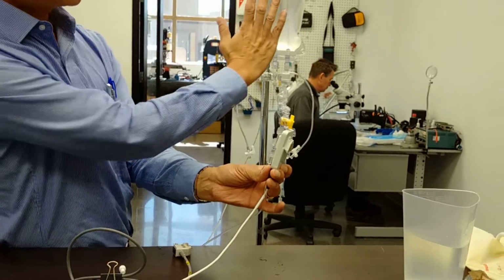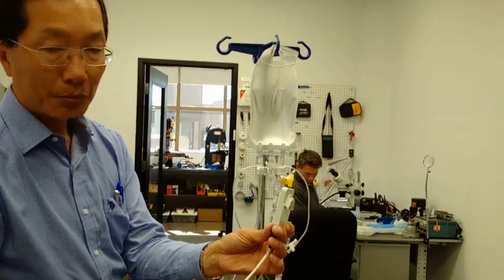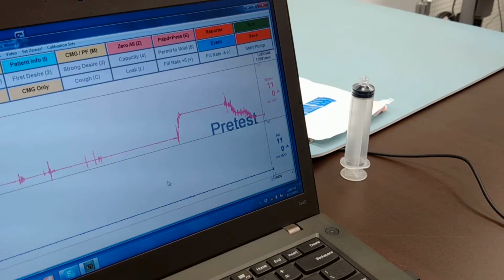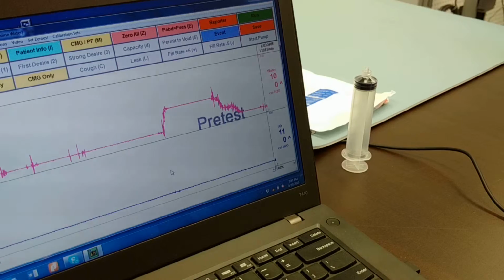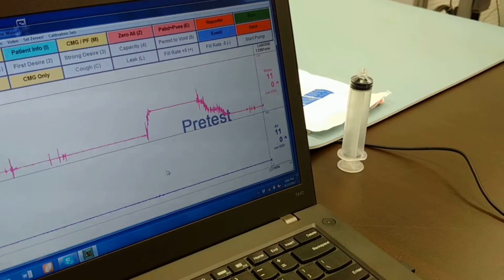Okay. Now remember, we can't really see this bladder because it's in a real patient, it's opaque. We would raise this until the two numbers are the same. So the urodynamic says this is the position that's the same. And so what's really important is that we now have a guide, an absolute numerical guide, that tells us where to place the water transducer when there is a patient movement or patient change in position.